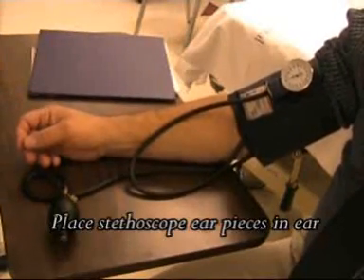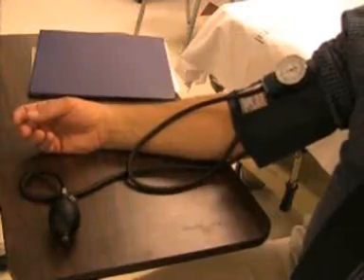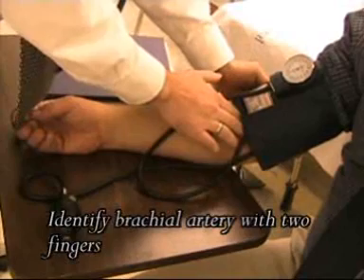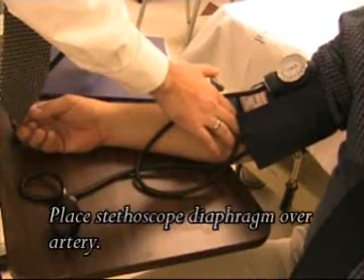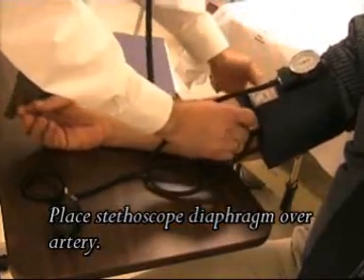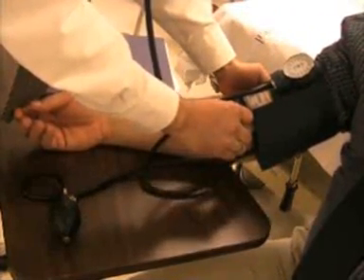Place the stethoscope ear pieces in your ear. Then with your middle and index finger, gently feel for the pulse in the bend of the elbow — that's the brachial artery. Once you feel the artery, place the diaphragm of the stethoscope on the brachial artery and listen for a heartbeat.